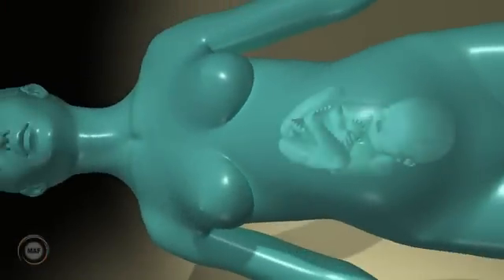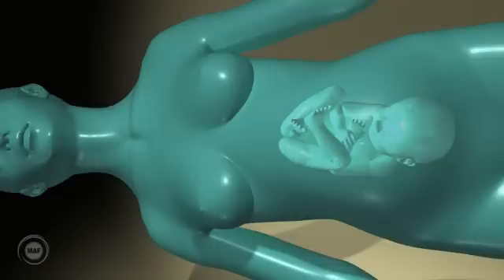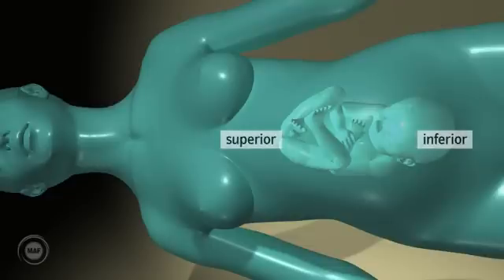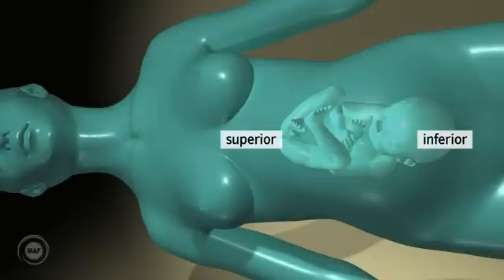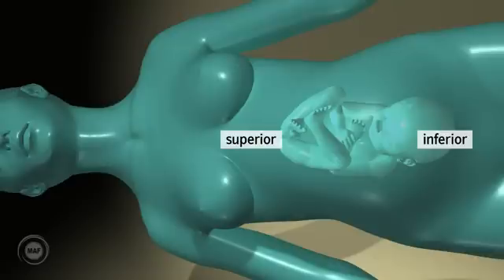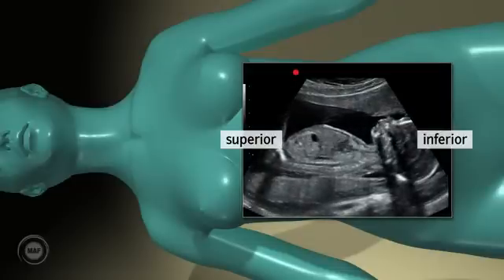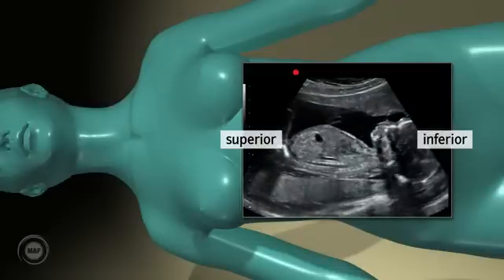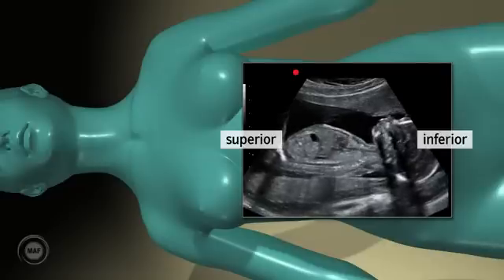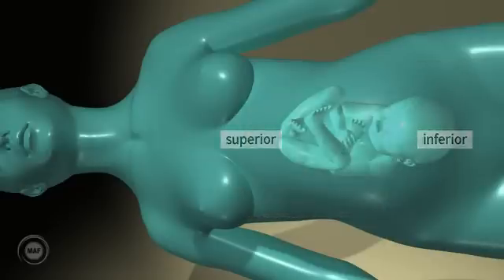In the longitudinal plane, the left side of the screen represents the superior part of the mother, and the right side represents the inferior part of the mother. So when scanning in the longitudinal plane, the mother's head is represented to the left of the screen and her feet to the right. The location of the dot on the screen should correspond.